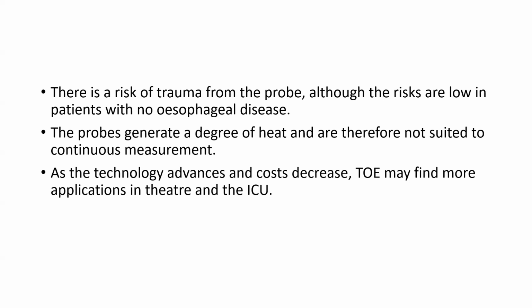The probes generate a degree of heat and they are therefore not suited to continuous measurement. As technology advances and the cost decreases, transesophageal echocardiography may find more application in theater and the ICU.